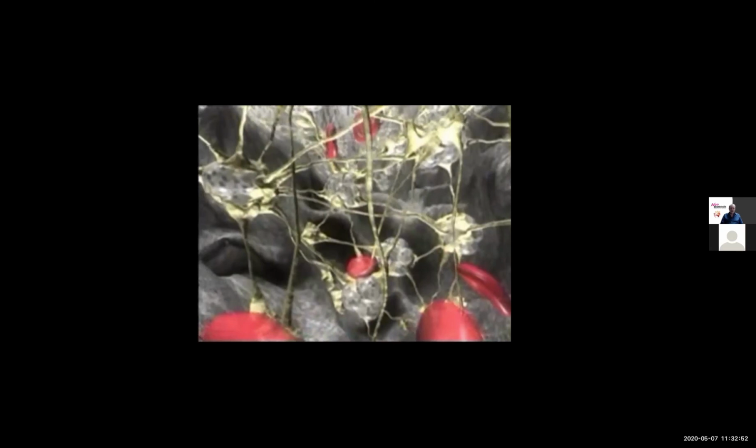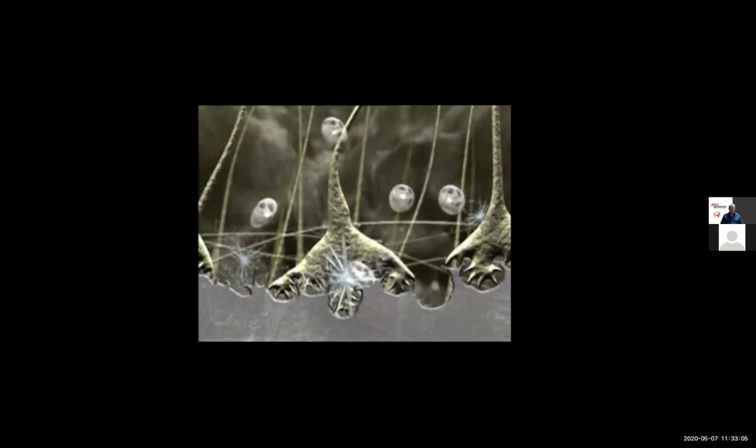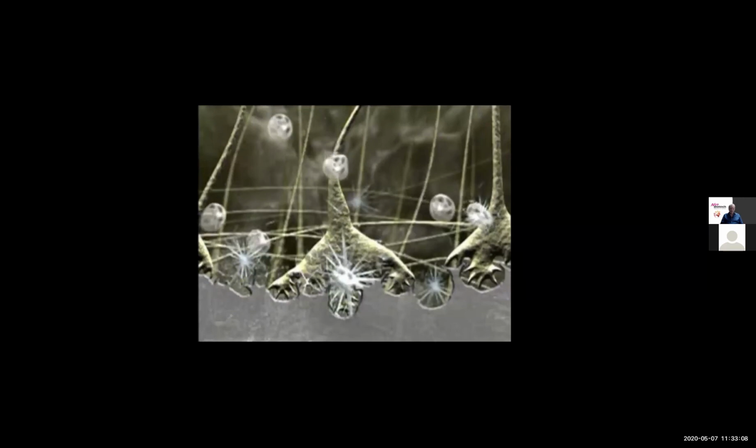We see here there are fibrils that are forming a network upon which the osteoblast is going to attach to the implant. The result is an interface attachment of woven bone to the implant.